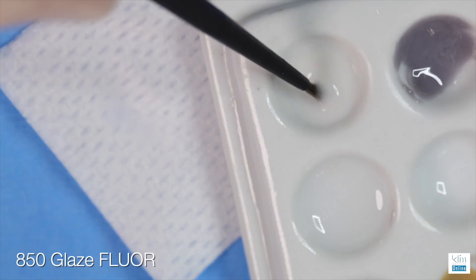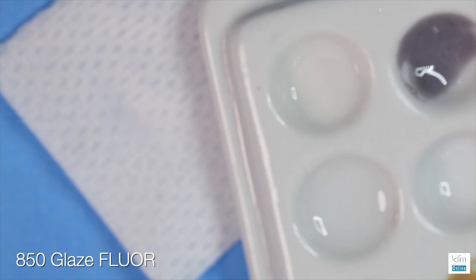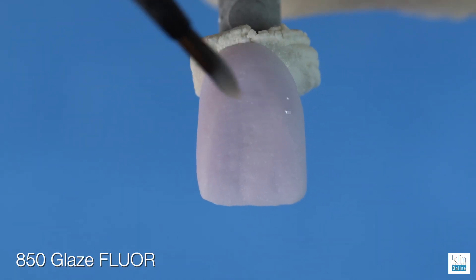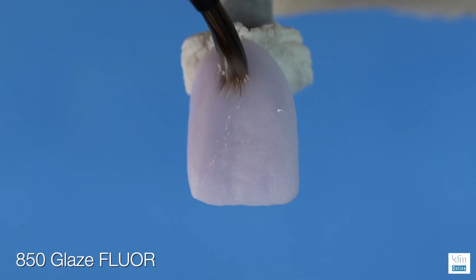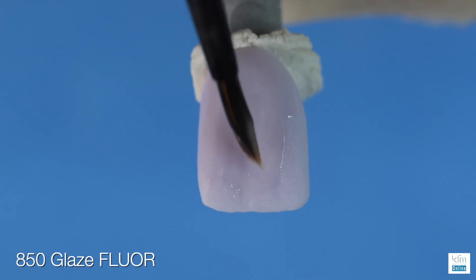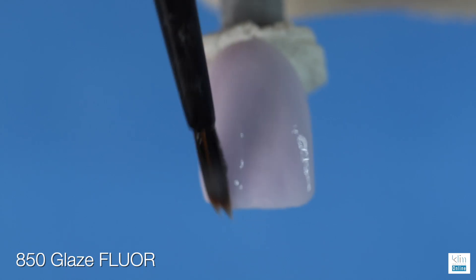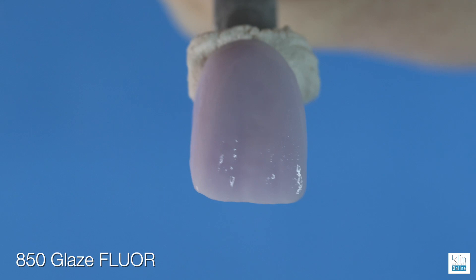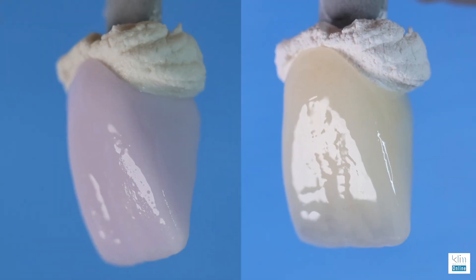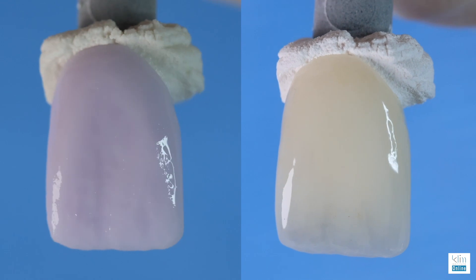Pick up the glaze with the bristles and add to the restoration horizontally along the cervical margins. You will find one application with this number three brush will apply enough glaze to one surface of the restoration. The MEO glaze is very special — what you will find is the pre-glaze luster is the luster you'll see after the firing with just one application.